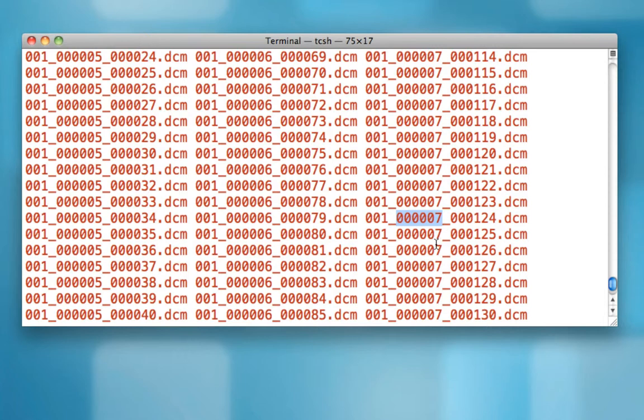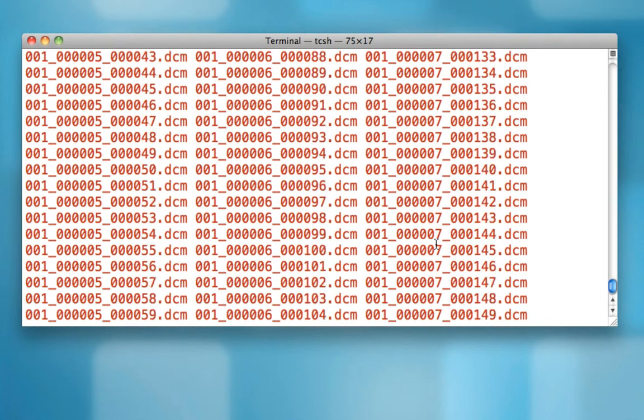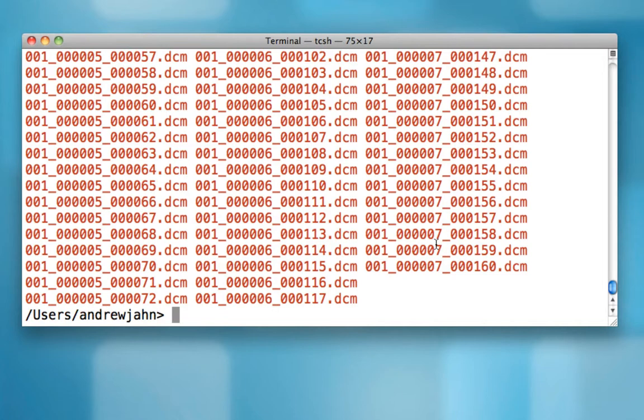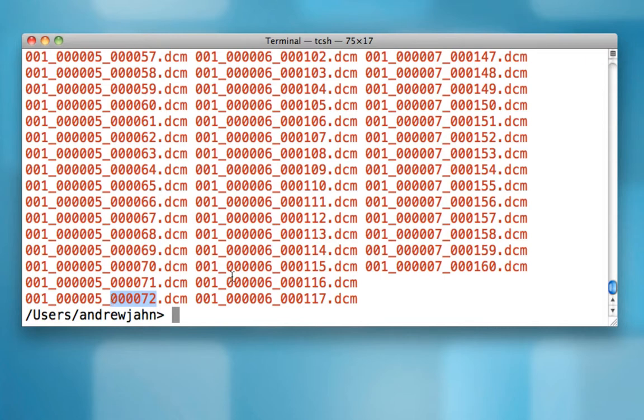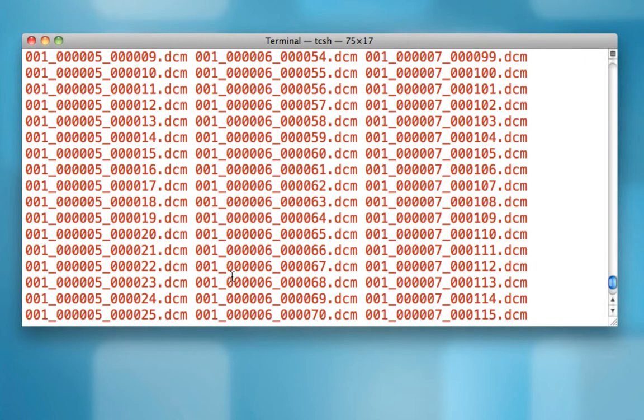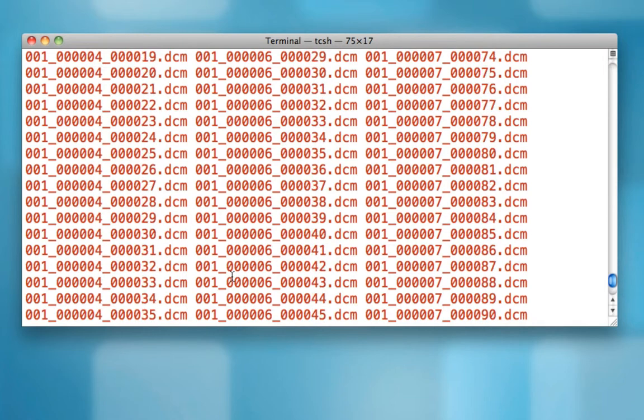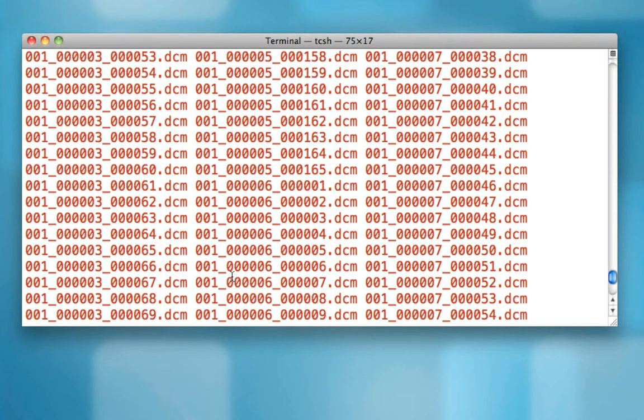So for right now, let's convert run number five into an AFNI data set and run number seven into an AFNI anatomical data set. Also notice that this last column right here is each volume. And for each functional run, there was 165 volumes. So if I scroll up here, you see that when run five ends, it's at 165 TRs or volumes.